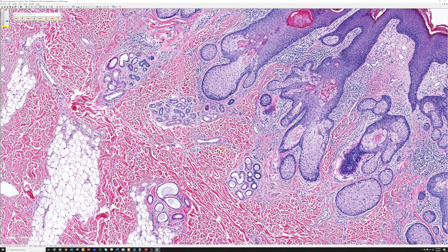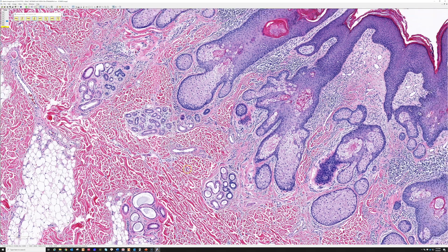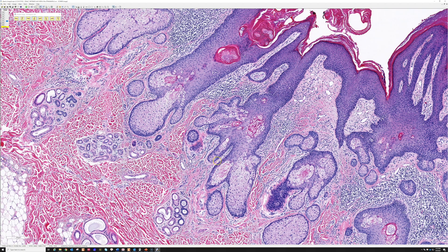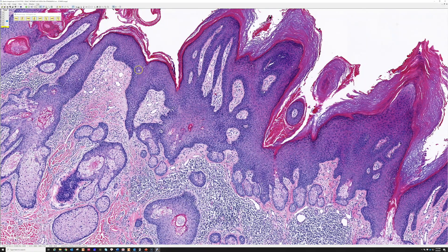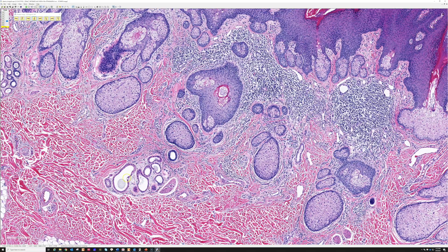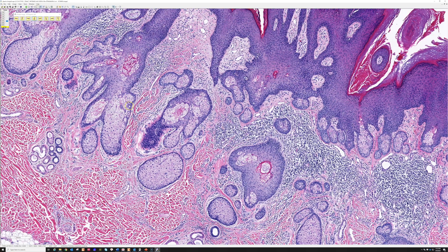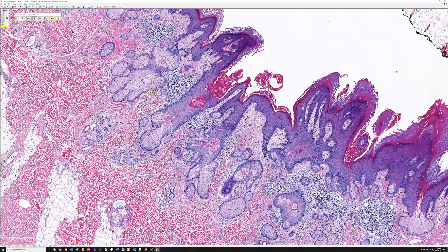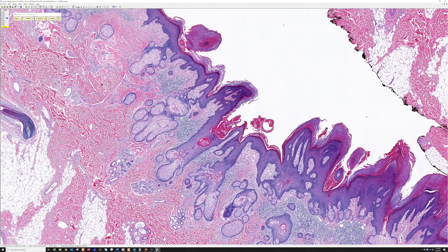If I see apocrine glands in skin elsewhere, I instantly think of nevus sebaceous or the closely related condition called epidermal nevus. Basically, if you have this epidermal proliferation present since birth but without the sebaceous glands and apocrine-eccrine glands, I would call it an epidermal nevus — another benign hamartoma closely related to nevus sebaceous. Usually the scalp is where you see it, but it can occur on the face and occasionally the trunk.